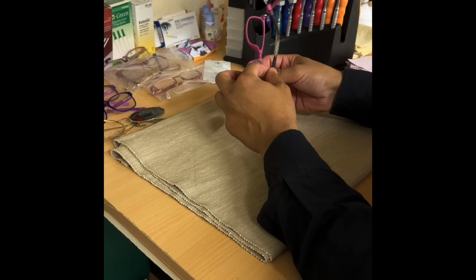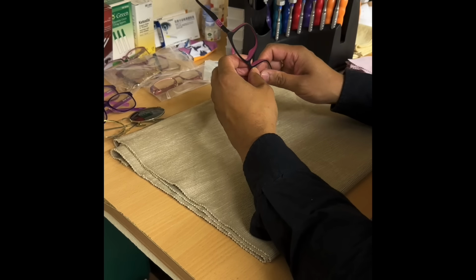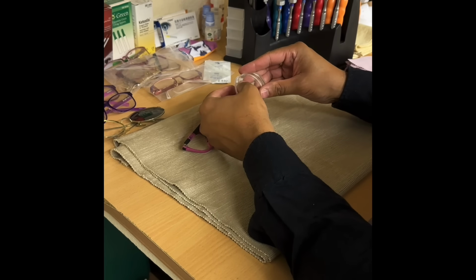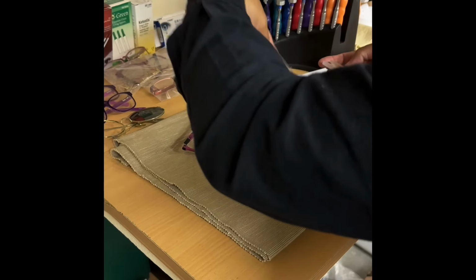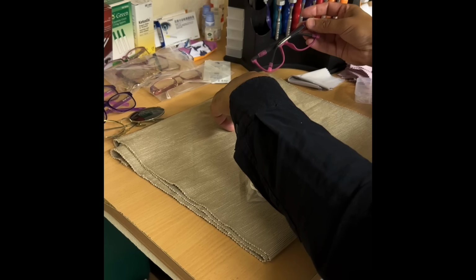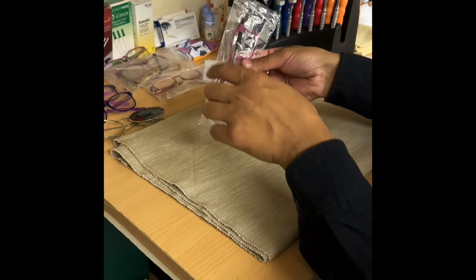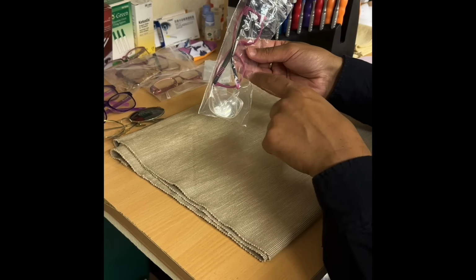This frame is ready for the scrap heap. So let me place the lenses back in the bag. Frame is obsolete. So I'll try and order a new frame and place those lenses into the new frame, and then you just come back in for a fitting.